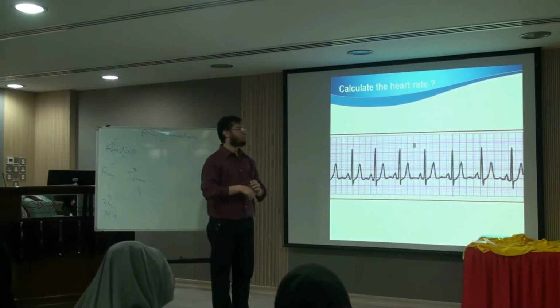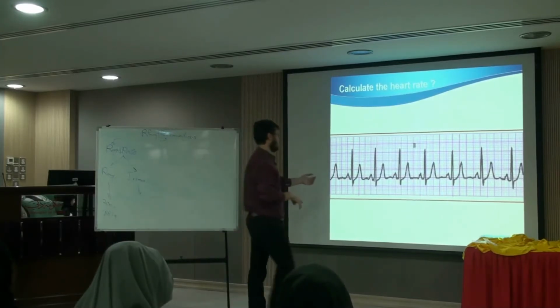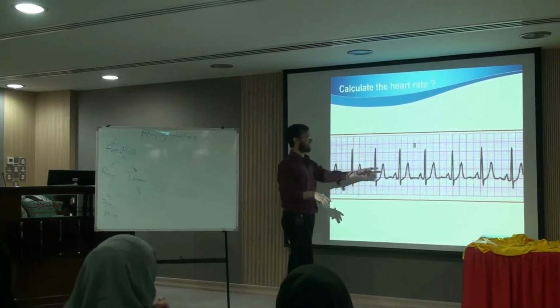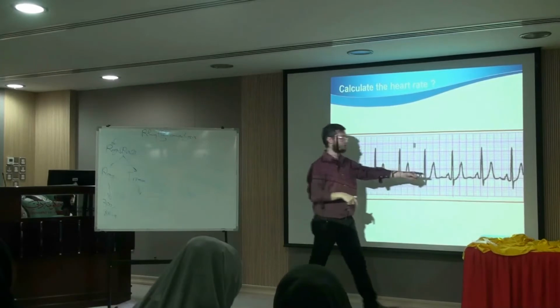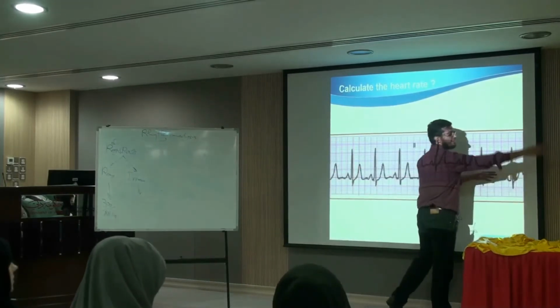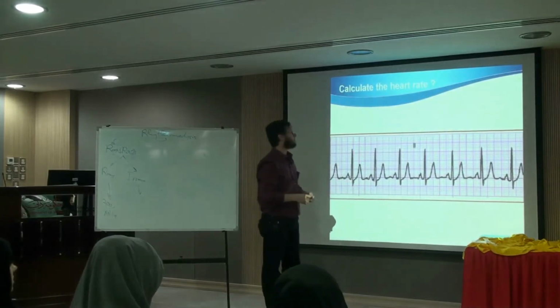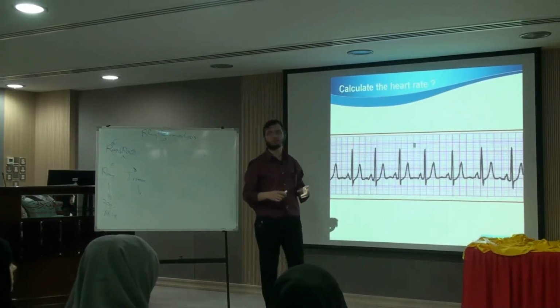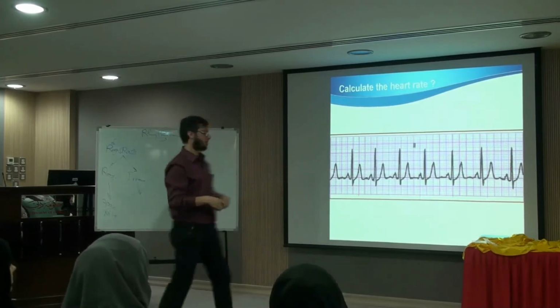But we don't have this much patience on the ECG, because this rhythm strip maybe has only 30 large squares. If you imagine 300, we would need to reach till the end of this lecture hall. So we do not do this. We count only 30 large squares.